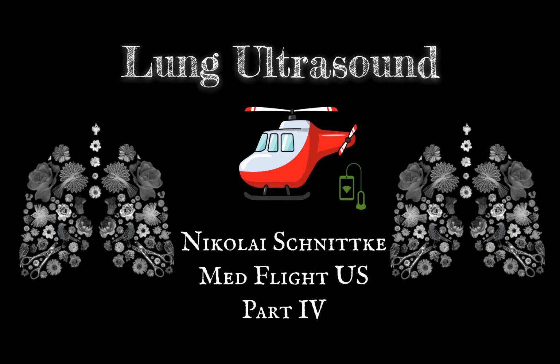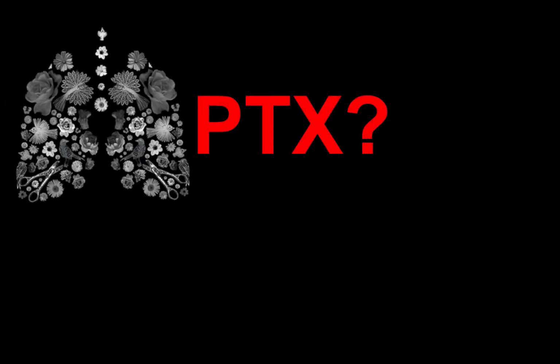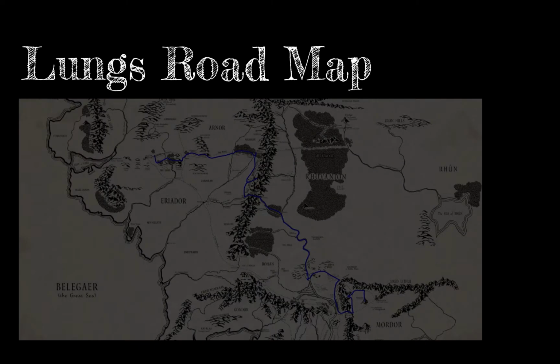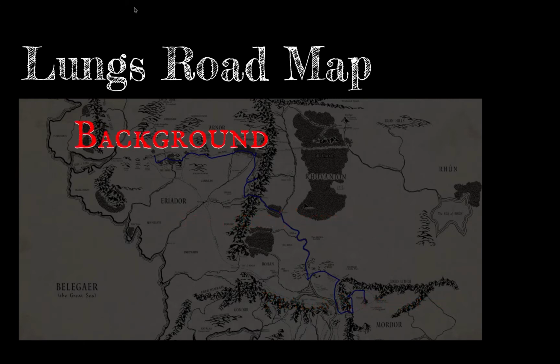If you can, I really urge you to take a break between these two so that everything is presented in digestible pieces. Today, we're going to focus on two questions pertaining to the lungs. Number 1, is there a pneumothorax and does the patient need decompression? And number 2, are the lungs excessively dense as they would be in ARDS or pulmonary edema, and would fluid hurt these patients? We'll start by talking about some background concepts, then the scanning technique itself, and then some pearls and pitfalls of this particular scan to prevent you from falling flat on your face. Let's start with the background.